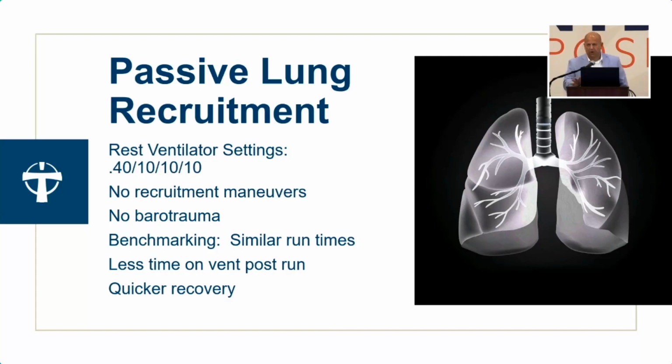And so I prepared all of these documents and policies about how to do lung recruitment on ECMO. And again, coming from the neonatal world to the adult world, trying to learn, okay, so bigger tidal volumes, bigger ET tubes, right? Maybe more pressure. And I sat with him, all these great policies, IPV, this and that. And he goes, nope, I believe in passive recruitment. I'm like, okay, sounds good. All right, nice working with you. So it's been quite a challenge to sit back and go, okay, I learned something new, David.